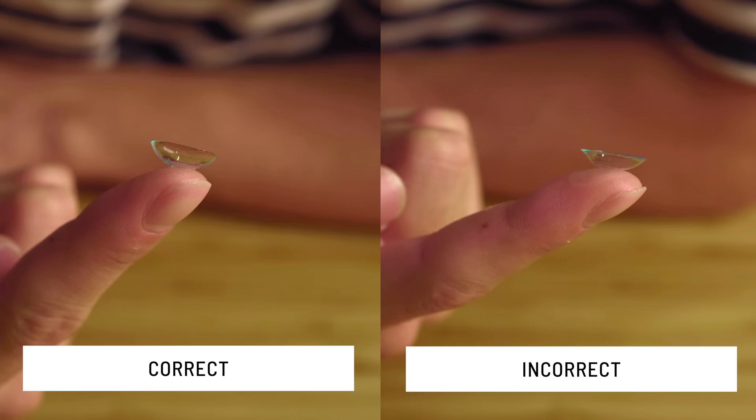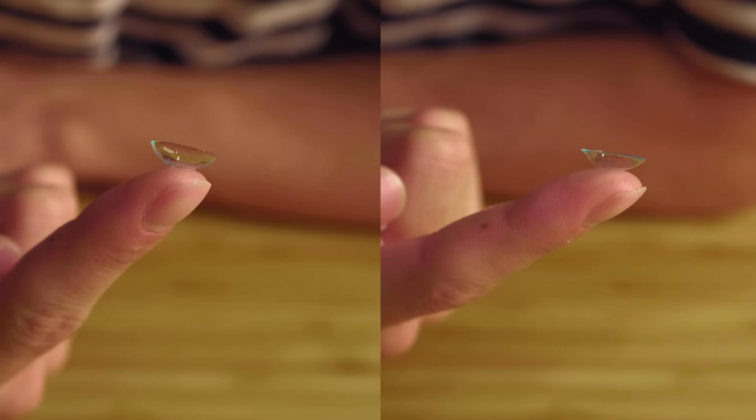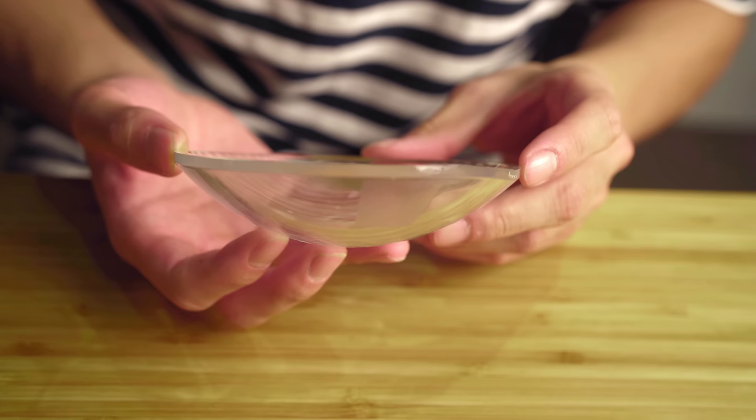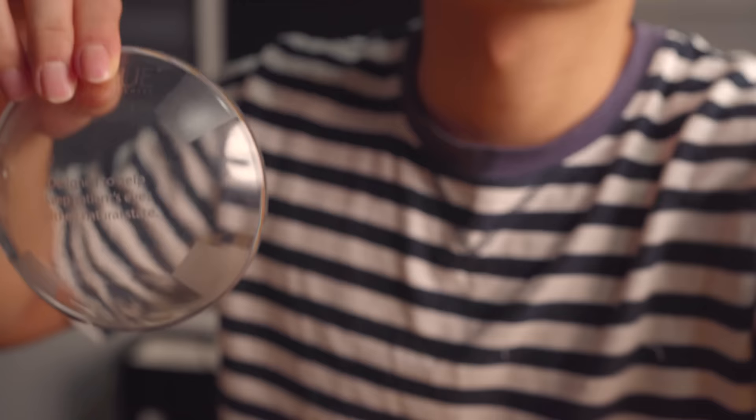If you find that your contact lenses look more like a taco rather than a bowl, then all you have to do is flip the lens inside out. If you're a beginner, then spotting these differences are going to be very difficult, but luckily in 99 cases out of 100, the lens will be positioned in the bowl formation straight out of the packaging.